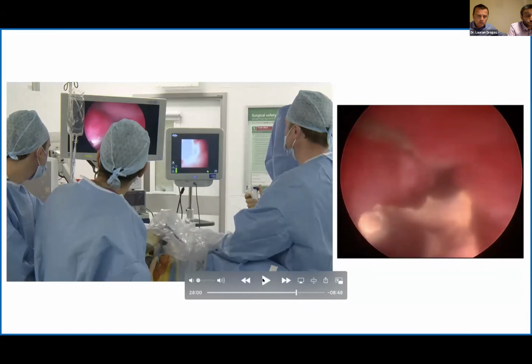Yeah, I think that's something that's worthwhile looking at through the BAUS section. So that's a very good idea. And then another question: is there any real risk of damage to the basket with the Trilogy device?